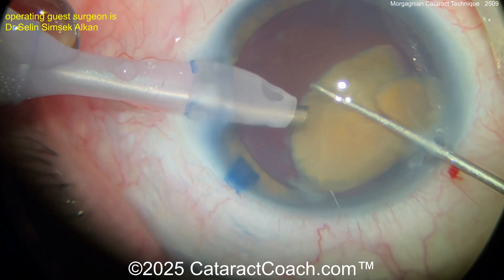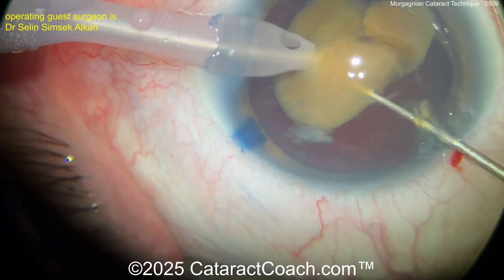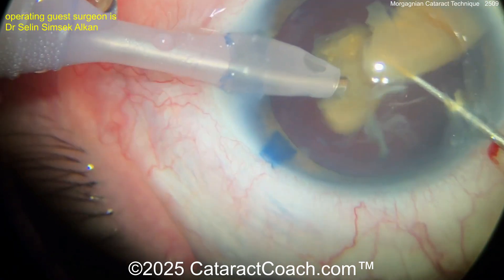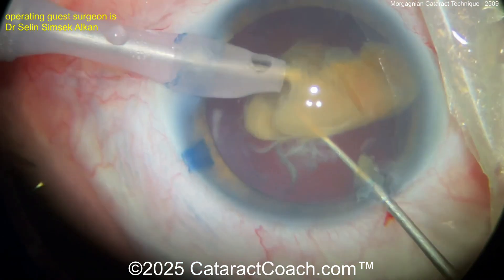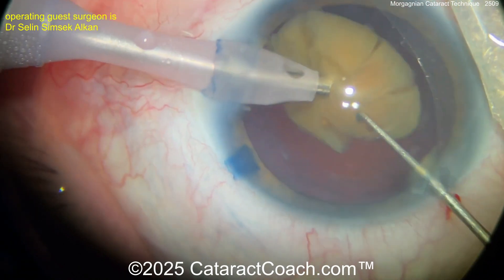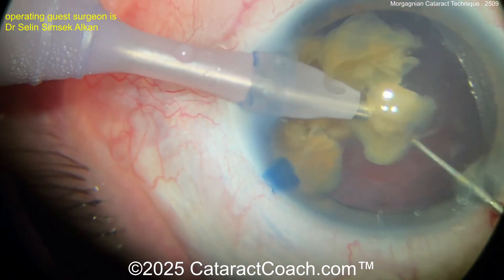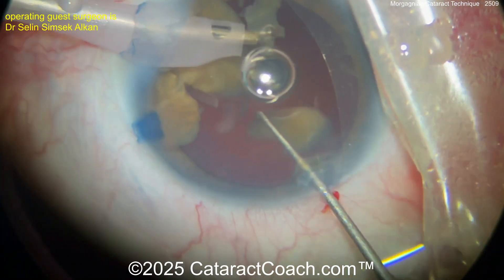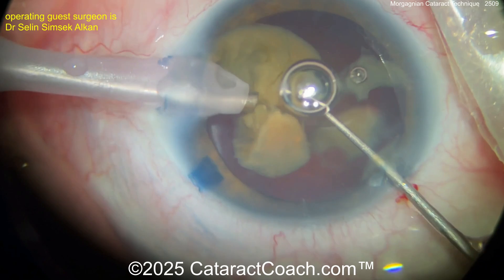Buzzing in again with the phaco probe. Bring that piece — there you go. Buzzing again, get the chopper behind it. Break that thing up. Chip, chop, flip, flop — get that thing aspirated down. As I say, wolf it down. Now pieces are coming out nice and easy. This is not a tough case, but you just got to know how to do it.